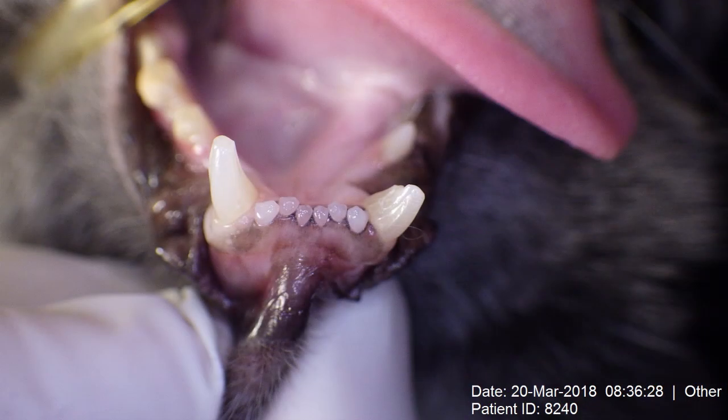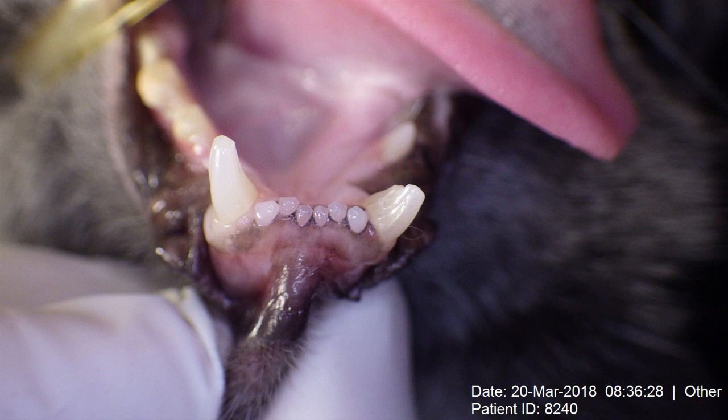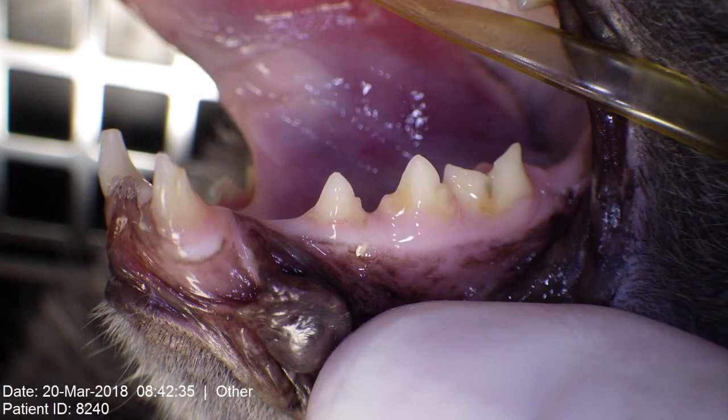In this preoperative photograph we can see significant coronal damage to the lower left canine tooth. In a cat, such damage is almost certainly going to involve pulp exposure and therefore endodontic disease. The lower right canine also has some minor damage but it was deemed irrelevant on clinical and radiographic examination. Here's a lateral view of that lower left canine tooth showing the coronal damage.